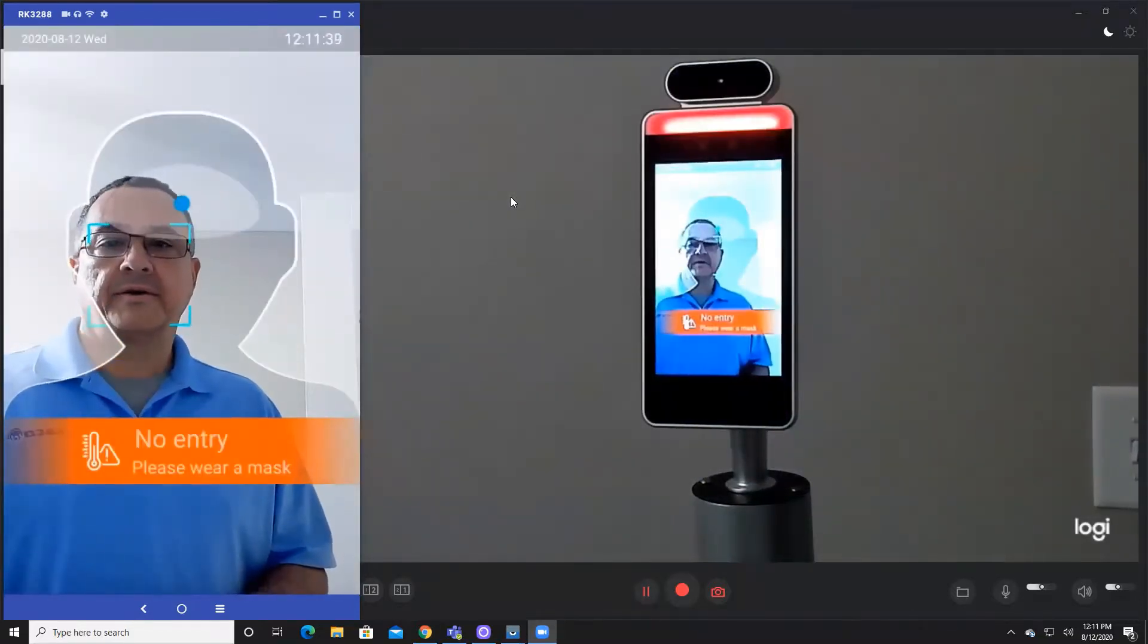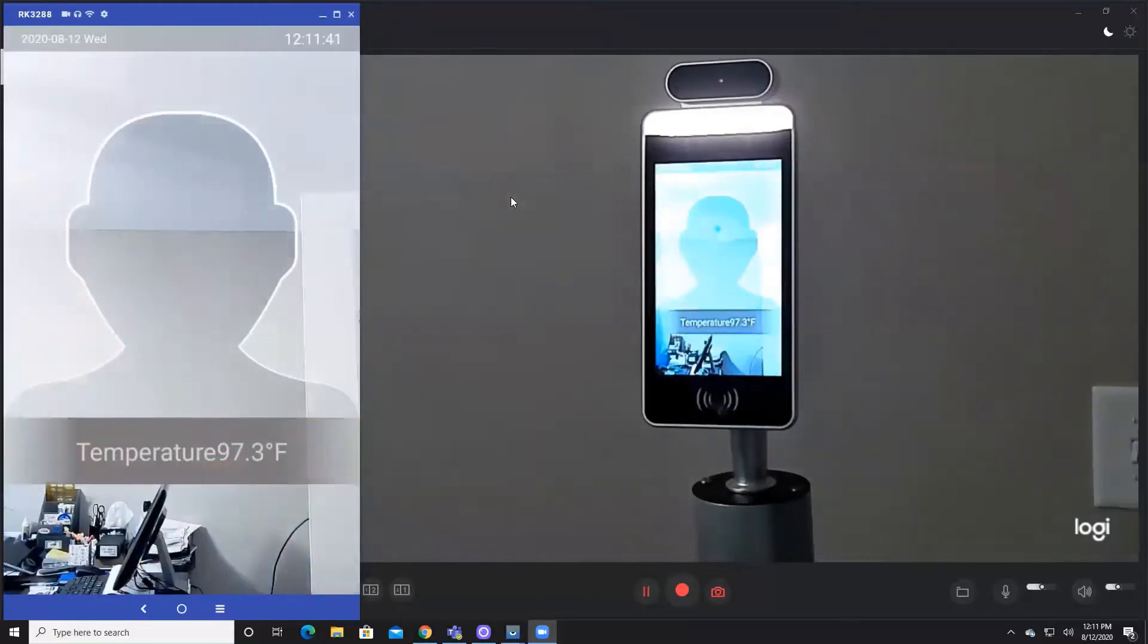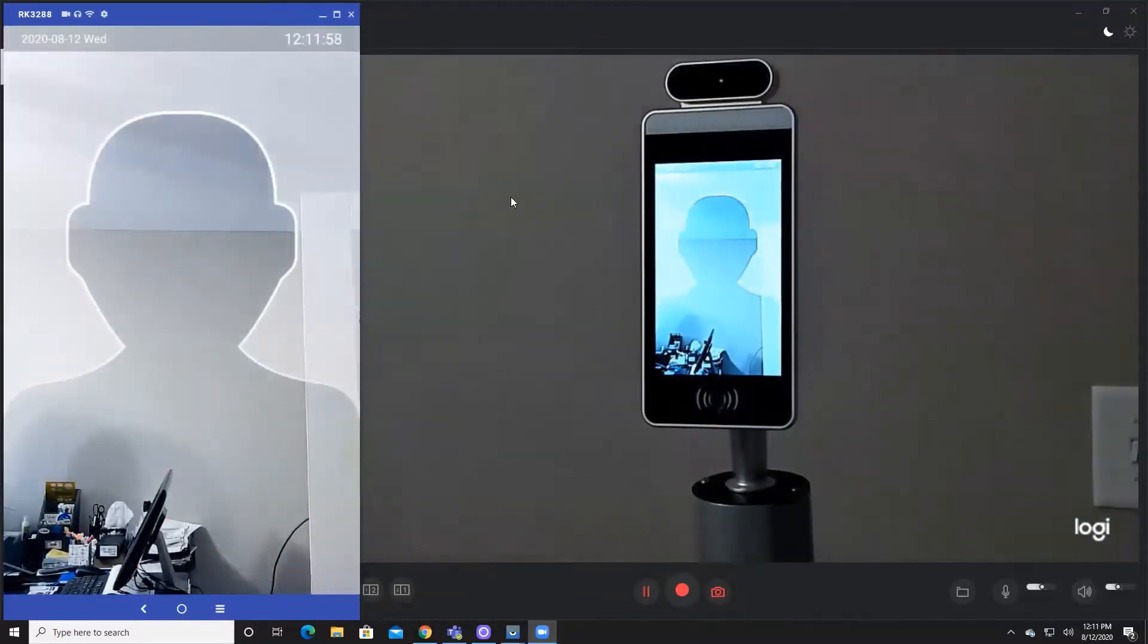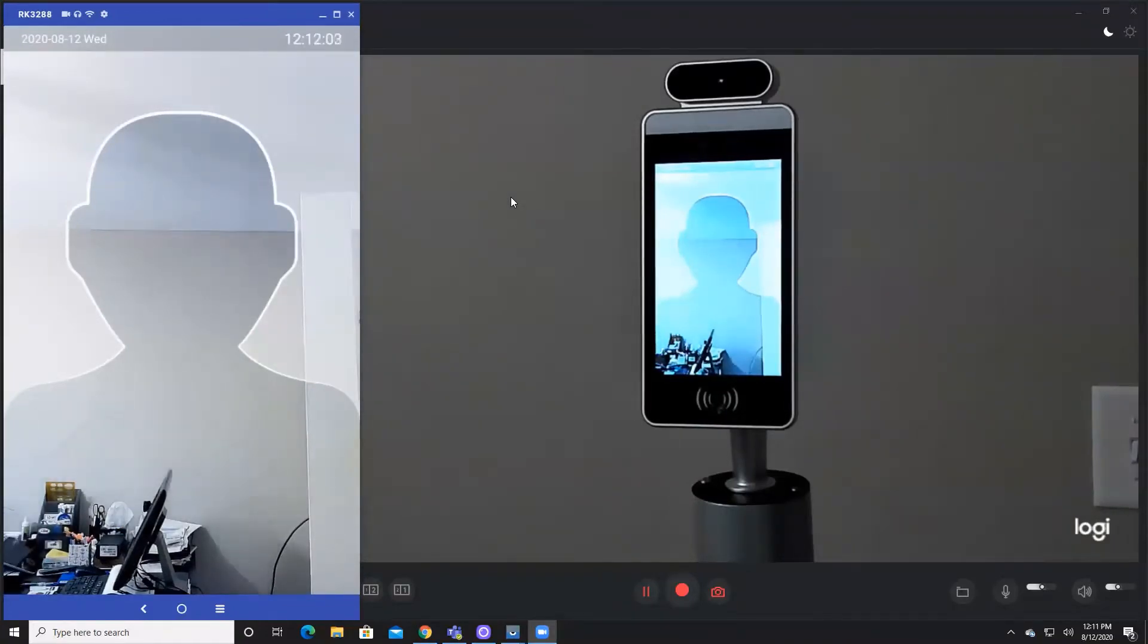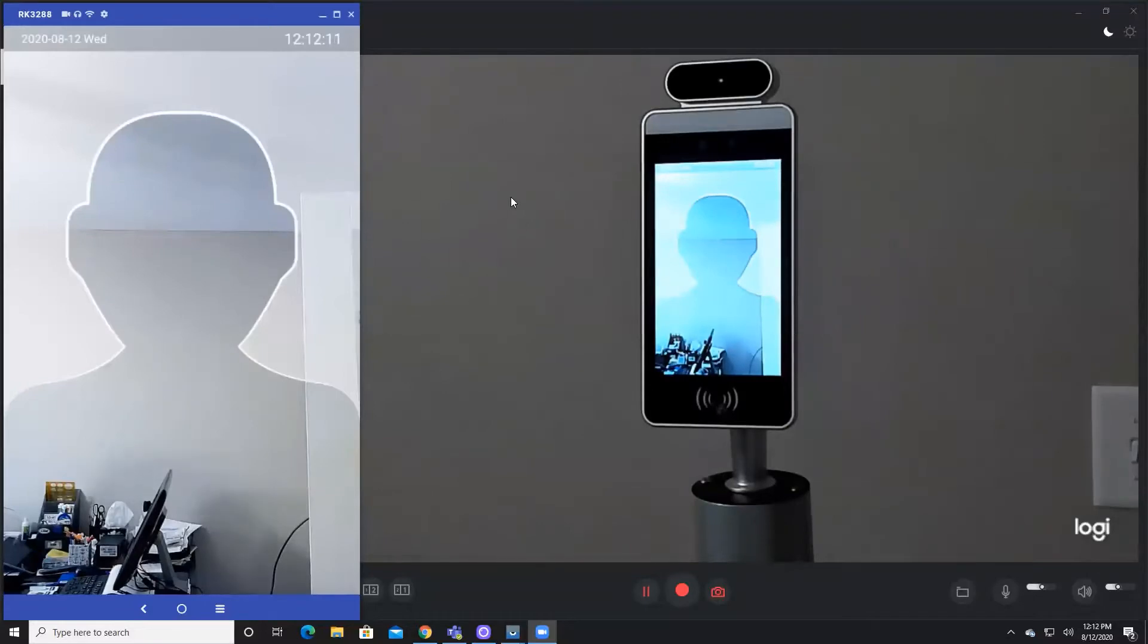At normal temperature, you heard the device prompt me to wear a mask because the algorithm is set up to look for a mask-like feature on the person's face. The temperature is normal, so it did say the temperature is normal.